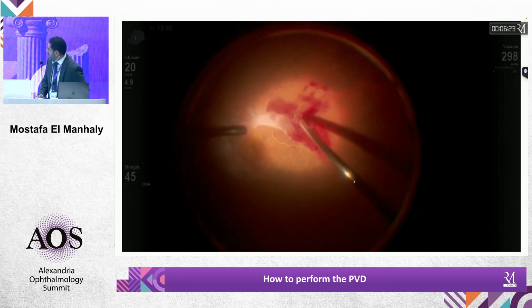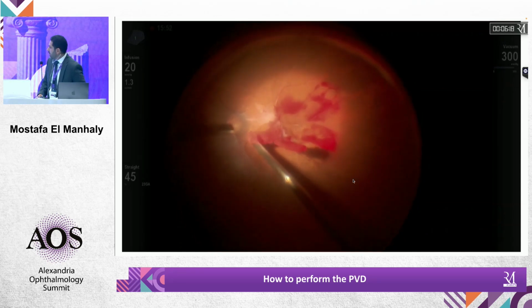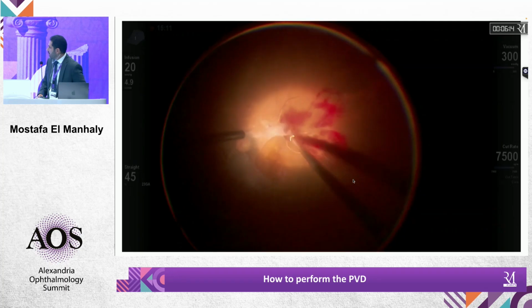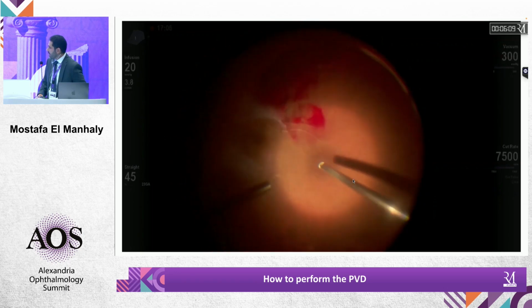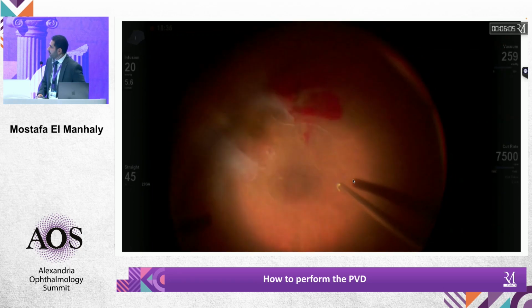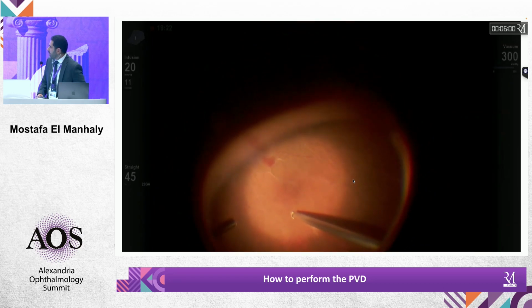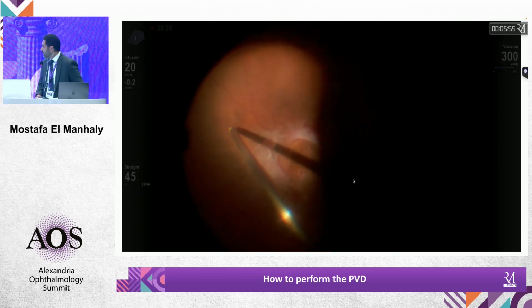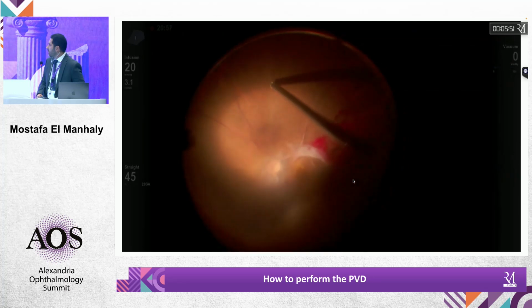Okay. Mustafa, would you like to add? Yes, we are all talking about the importance of removal of subhyaloid hemorrhage as a first step. Actually, I keep it till the end. In diabetics? In diabetics, yes. I know exactly where the manifest traction is from the shape of the posterior hyaloid, and the presence of this layer of subhyaloid hemorrhage that is not clotted allows me much easier removal of blood if it accumulates on the posterior pole.